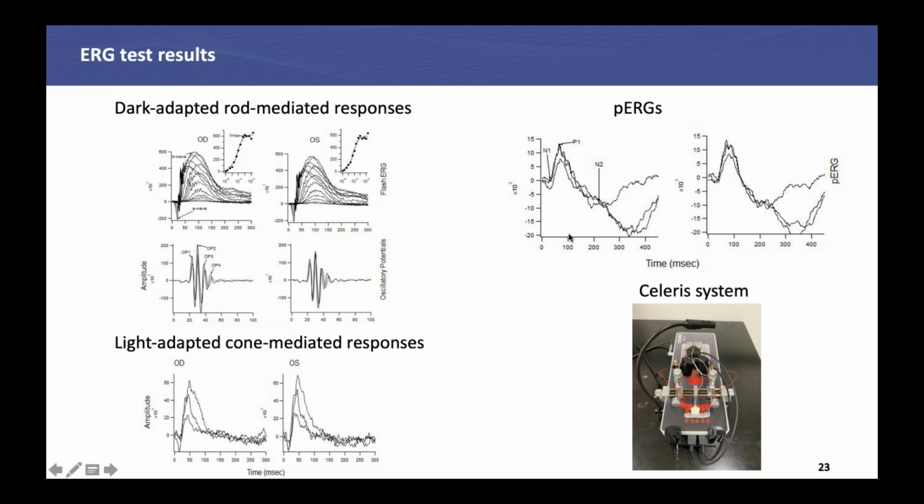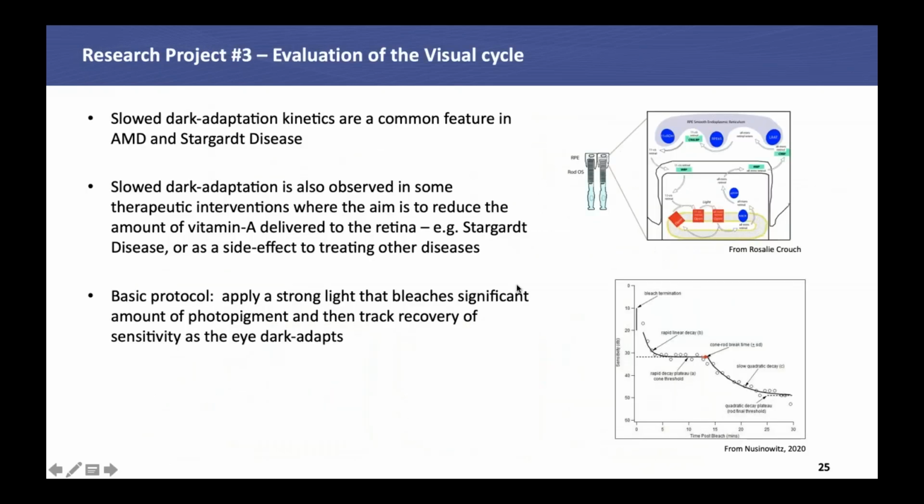But importantly, we're adding the pattern ERGs to this study, and these are really beautiful, again, symmetrical pattern ERGs. The different lines are for slightly different intensities near saturation of this response. They're not very big, but they're very clear, and you can easily pick out the peak components. Whoops, let me go back one.